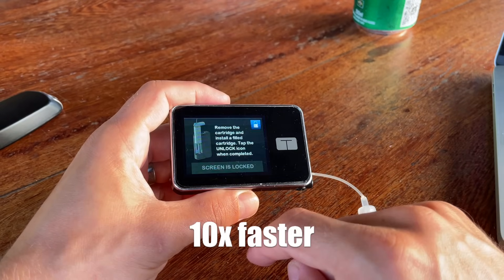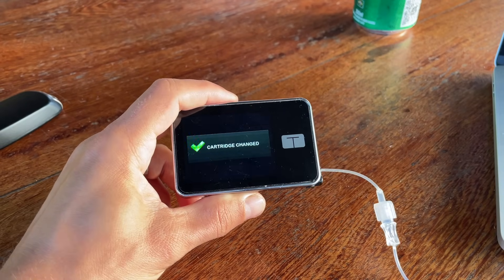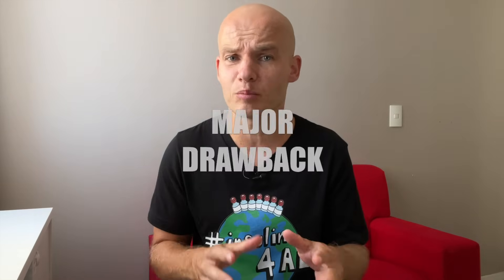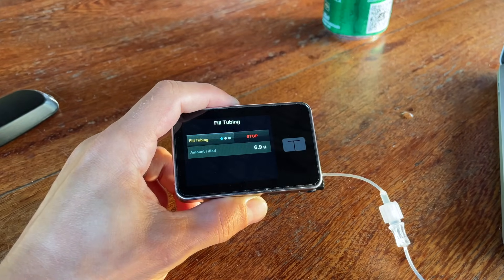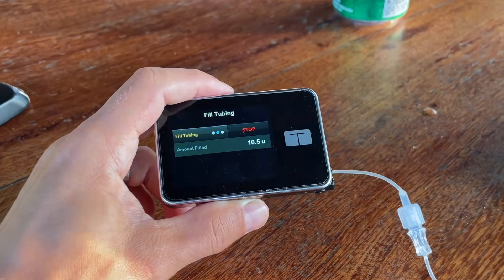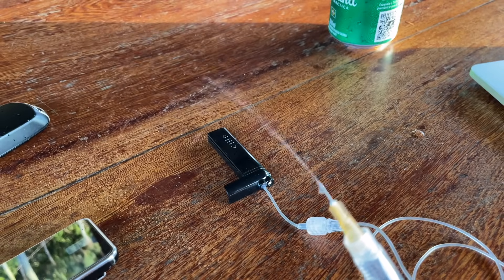Unfortunately the whole cartridge refill process is quite time-consuming and not as straightforward as with my Medtronic pumps. I definitely needed to do it several times before I got used to it. Here's another point where the safety features feel like overkill: whenever you refill your cartridge or run out of battery, the pump forces you to refill the infusion set with at least 10 units of insulin — which you don't have to do with most other pumps, and it sometimes leads to quite a bit of insulin waste.